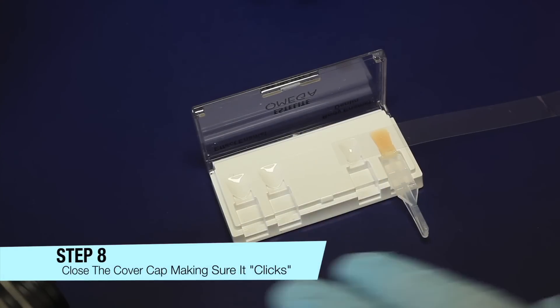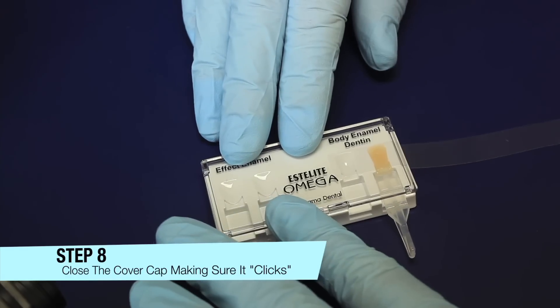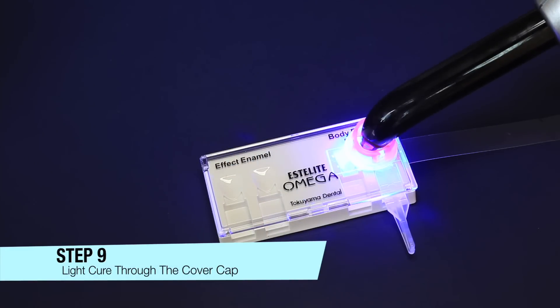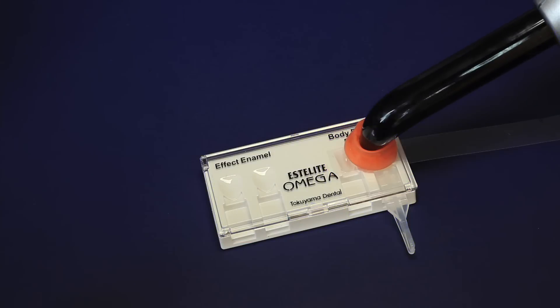Step 8: Close the cover cap and press down until it clicks. Step 9: Light cure through the cover cap for the length of time indicated in the composite manufacturer's instructions. Do not under cure.